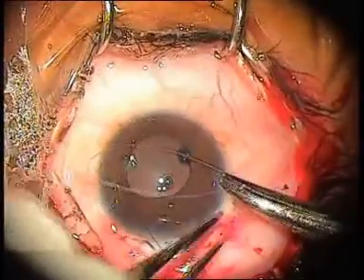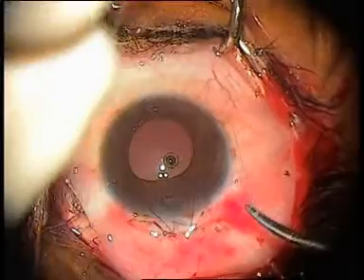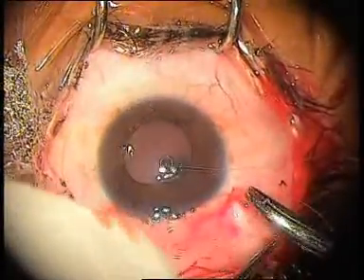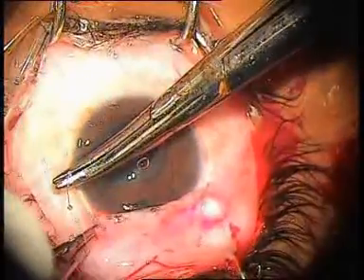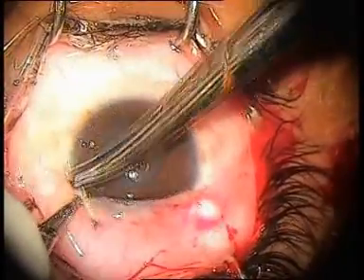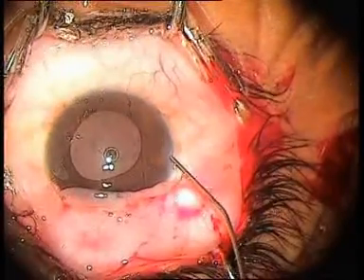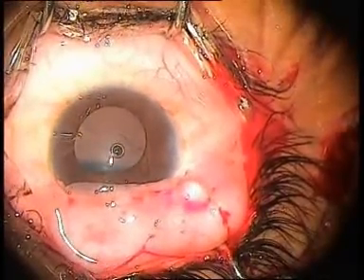The anterior chamber is reformed. Conjunctival closure is as important as a good flap closure to minimize postoperative leak and hypotony. 8-0 Vicryl sutures are used. Episcleral tissue is also taken in the bite. The two limbal conjunctival sutures should be taken tight enough to hold 1 mm of conjunctiva onto the limbus. This will prevent conjunctival retraction and bleb exposure postoperatively. The anterior chamber is formed through the paracentesis site.